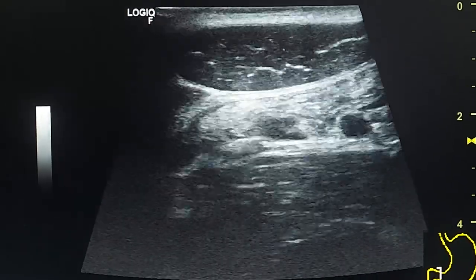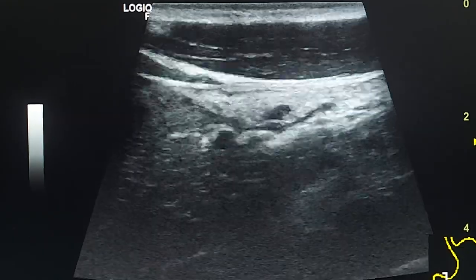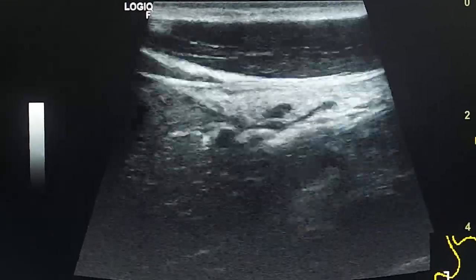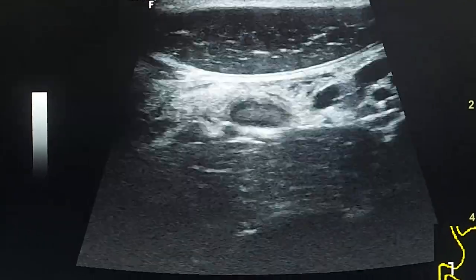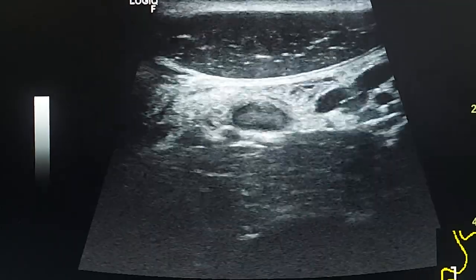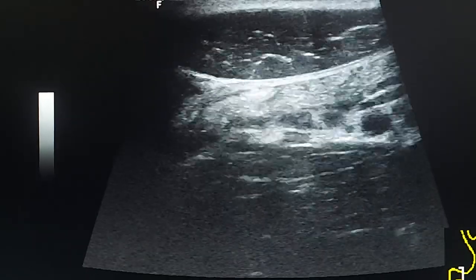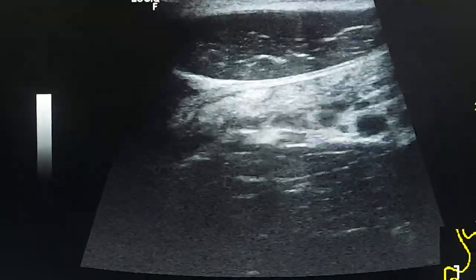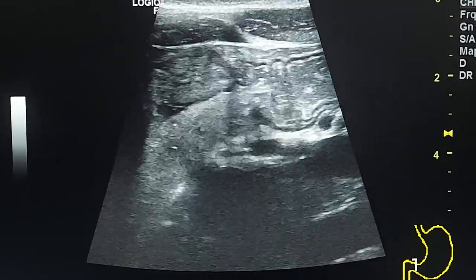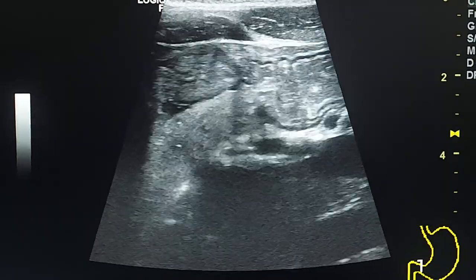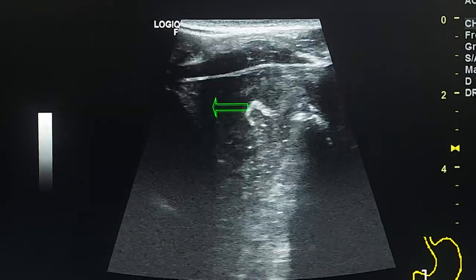In this view there is a lymph node with normal shape and echogenic fat around it. The fat hilum is preserved in the lymph node. This is the examination of the stomach after the patient drank water. Here we see the defect of the anterior wall.